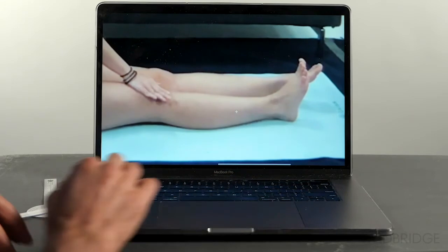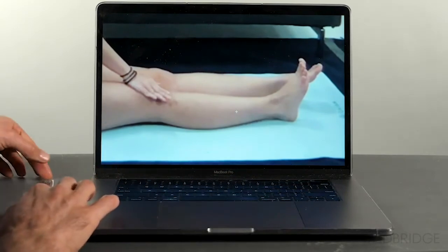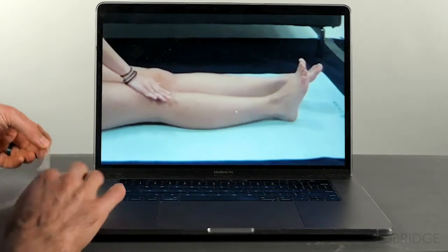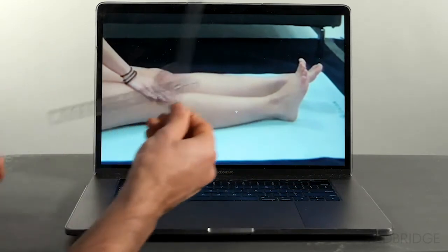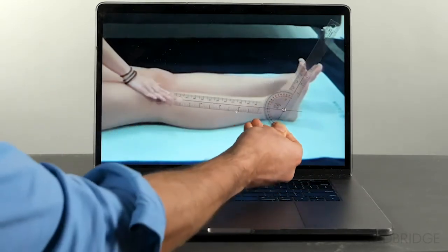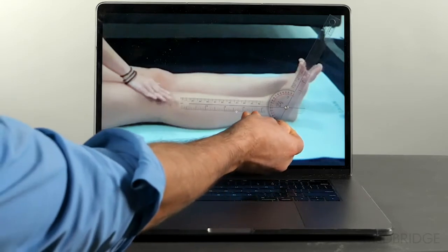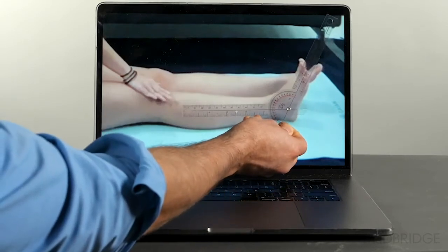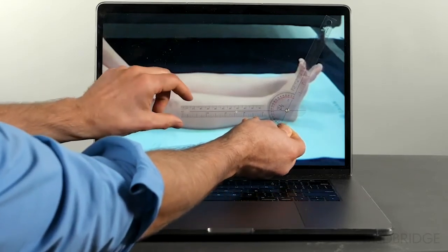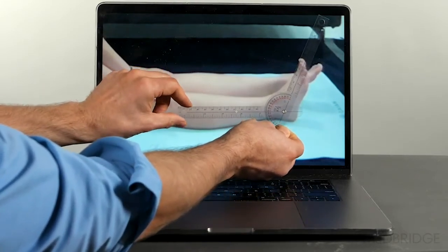I'm going to go in and take my goniometer, line up my landmarks, and this now allows me to measure her ankle dorsiflexion range of motion.